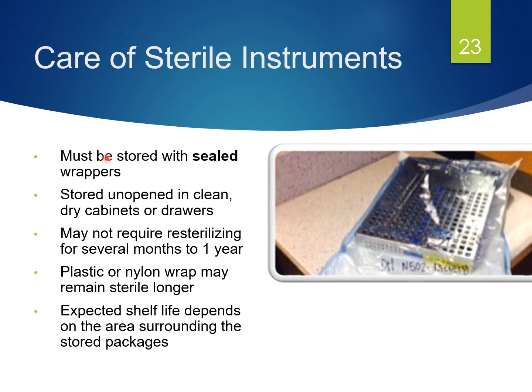The care of our sterile instruments is just as important as the processing. They must be stored with sealed wrappers. They cannot be punctured or opened, as that would render them non-sterile. Yours will be in your assigned lockers. In most offices, they're going to be stored unopened in a clean, dry cabinet or drawer.